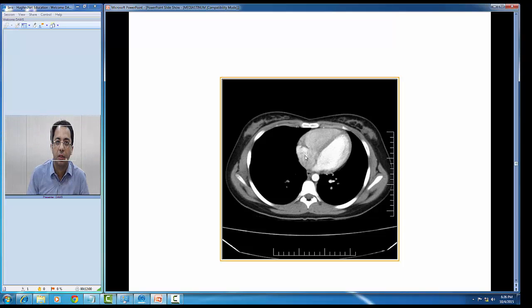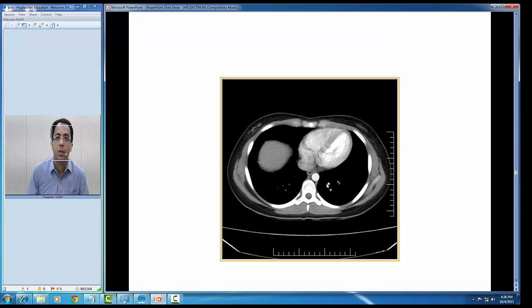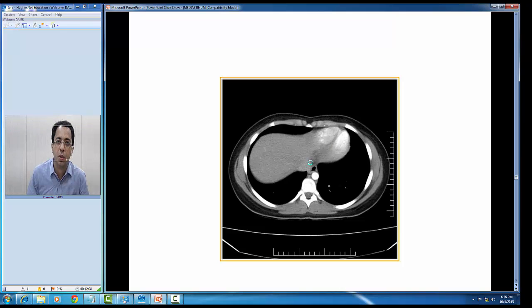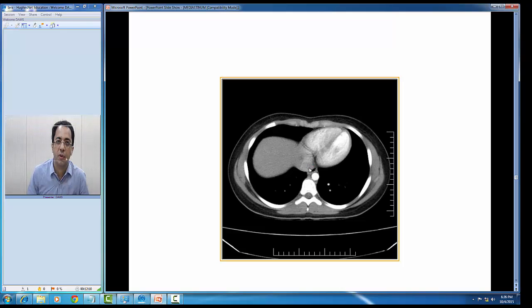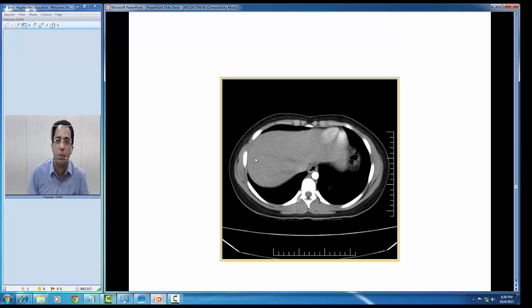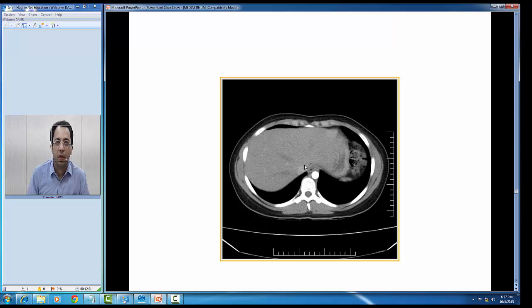Going down, you can see the interventricular septum, the left ventricle, right ventricle, right atrium, and left atrium. Further down, the right atrium is continuing into the inferior vena cava — this is the hepatic part of the inferior vena cava. You can see the esophagus, descending aorta, and the liver is now appreciable on the right side.